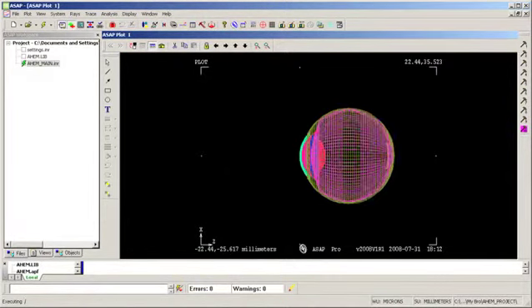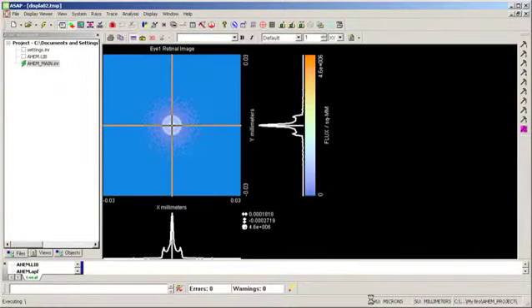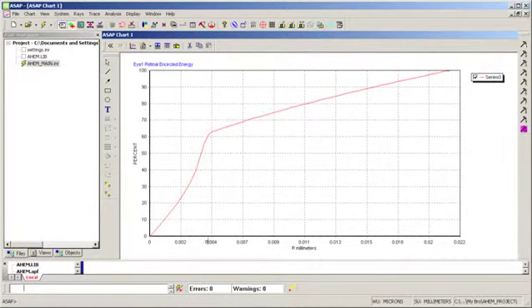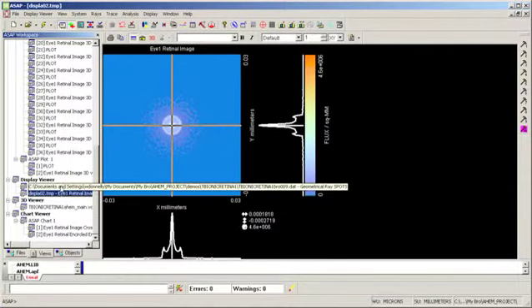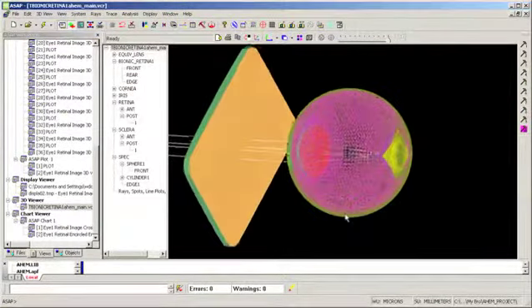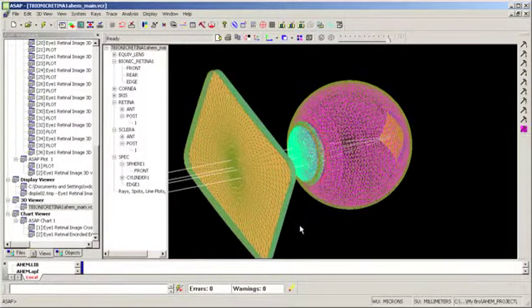You see the geometry drawn. There's my correcting lens, and I get a point spread function that's nice and tight. It looks much like the default model's point spread function, and also cross-section data. So there's my point spread function, and let's look at our geometry again here. So we've got a Bionic Retina inside the eye, and we're imaging on top of it.